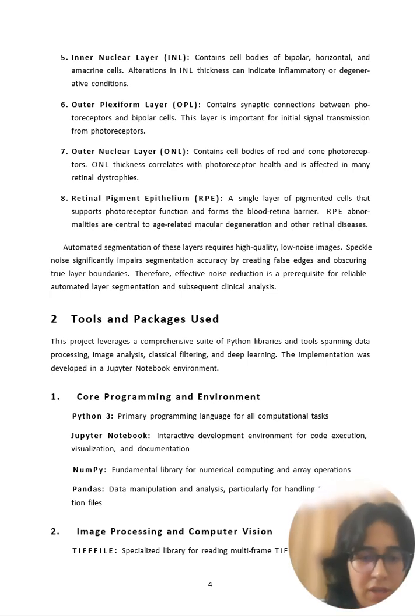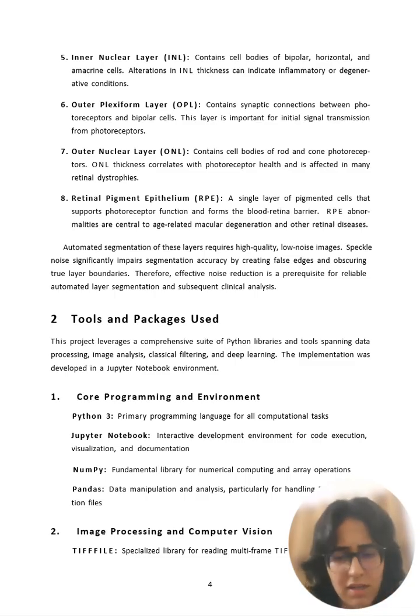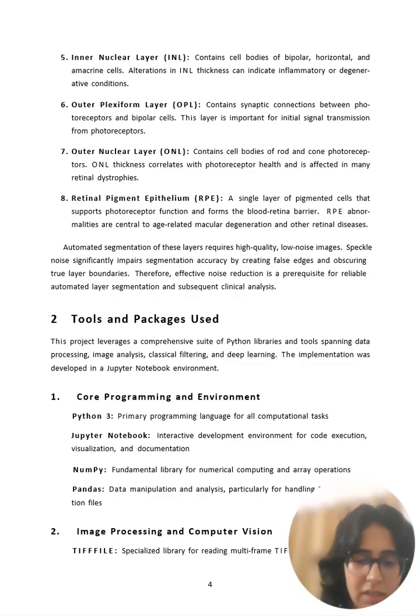So then we have talked about the tools and packages that have been used in the project. So the core programming environment that I have used is Python 3 as the coding language, and I have used Jupyter Notebook. NumPy is used as the fundamental library to compute and use array operations. Pandas for data manipulation and analysis, and particularly for the Excel files, which will be discussed further on what they contain.